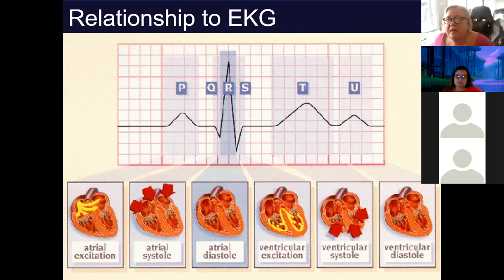So it could be normal for it to be inverted, that's particular to that person? Well, you need to look at the P wave first. Right. So they could be going up or down, which is normal, but if they're opposite, that's when it's abnormal. Correct. Okay. Thank you.